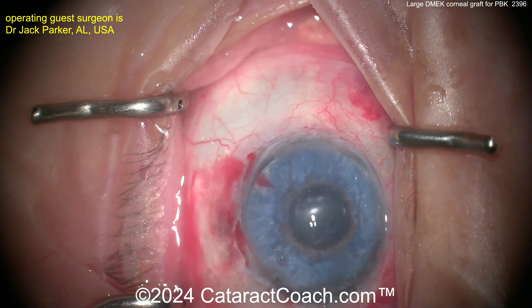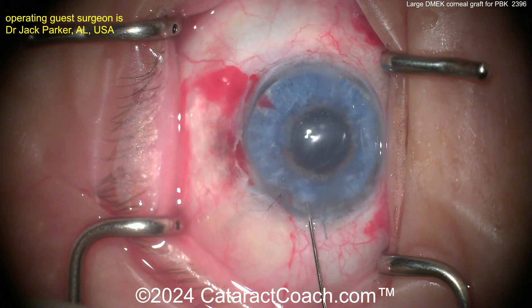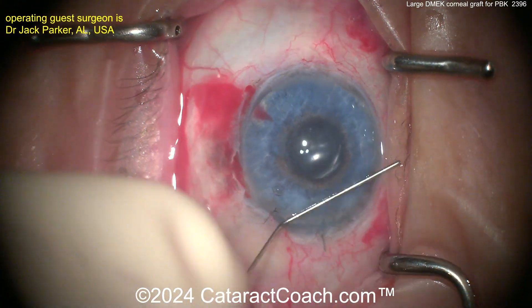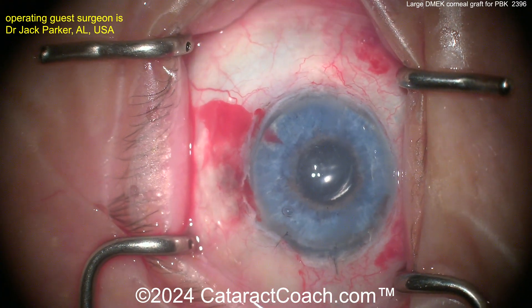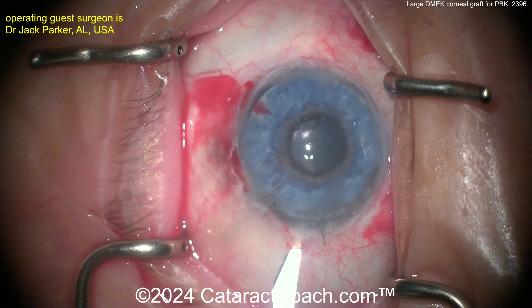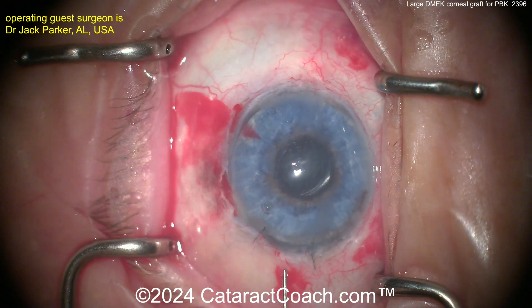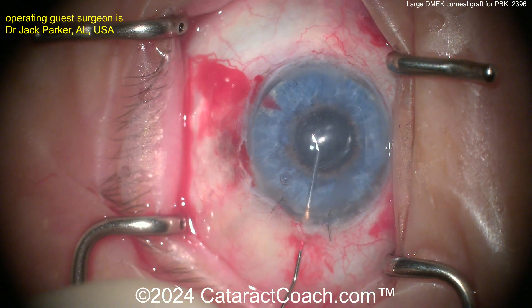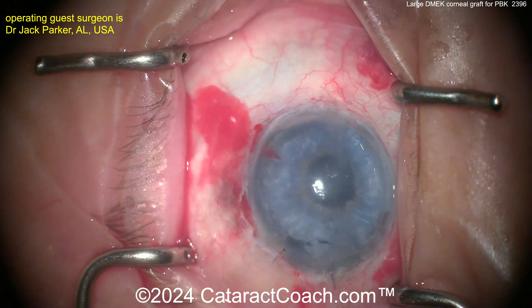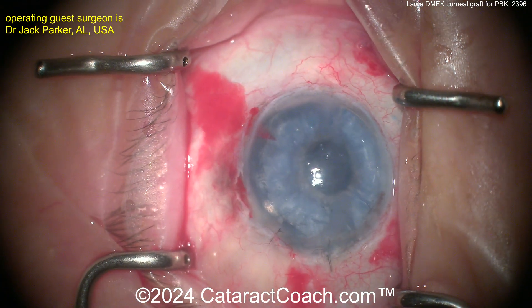The graft's in good position. For the air, Dr. Parker just puts in regular air — filtered room air — not using any special gases here. The patients do not have to maintain positioning for any period of time; they can just get up off the operating room table and resume essentially normal activities during recovery. A little bit more posterior now, making another pass with needles to get that air bubble in. You've got to get it, of course, under the graft. Here comes just filtered room air — there's the bubble, nicely done, nice and large, fill up there. That looks great. What a beautiful technique here.